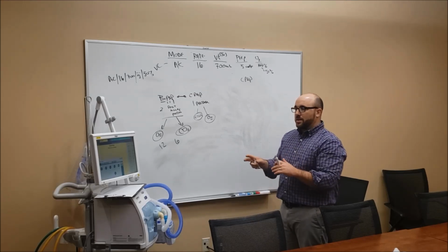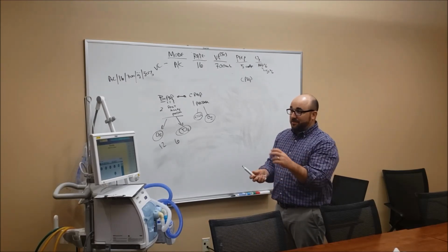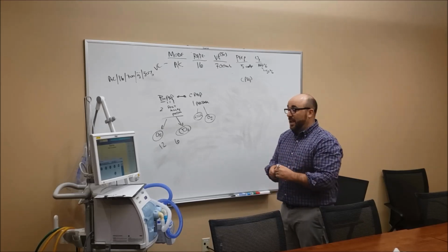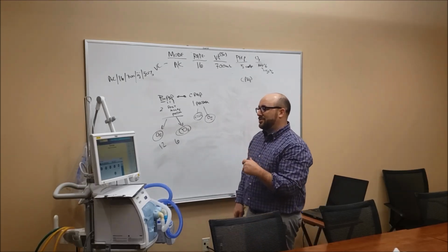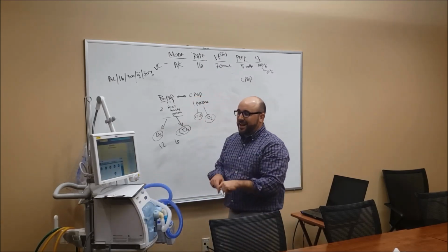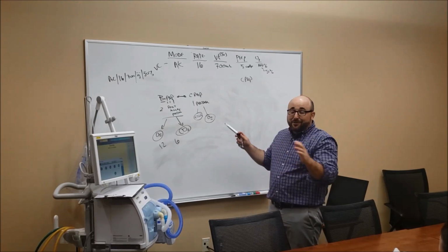We would much rather the respiratory therapist show up to a room where somebody says the vent was going crazy, with some red alarms and stuff, so I just took them off and bagged them. That is the absolute smartest thing to do. It doesn't happen all the time. A lot of times people are like, well, I remember this class Jimmy taught us, so we can change some stuff in here. So yeah, don't jack with the machine, because there are so many things that you can change with the machine that won't make any difference at all.